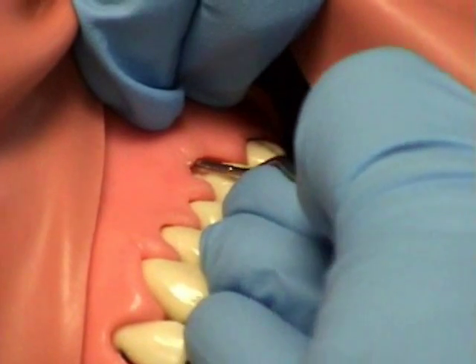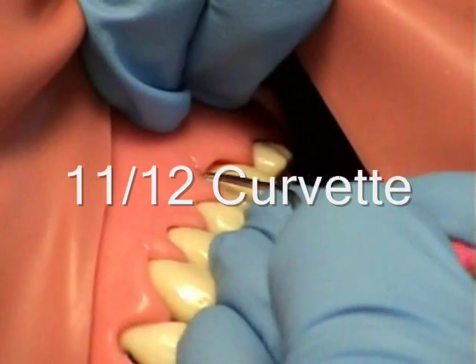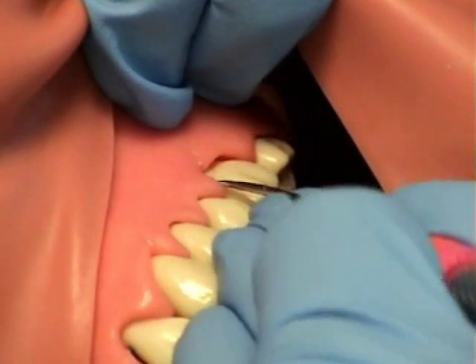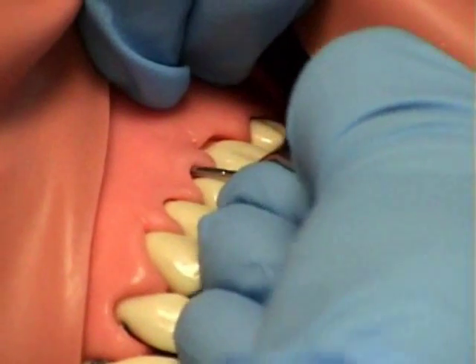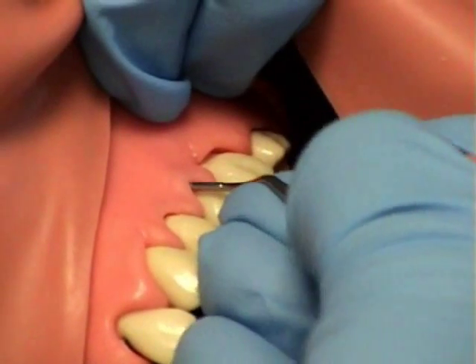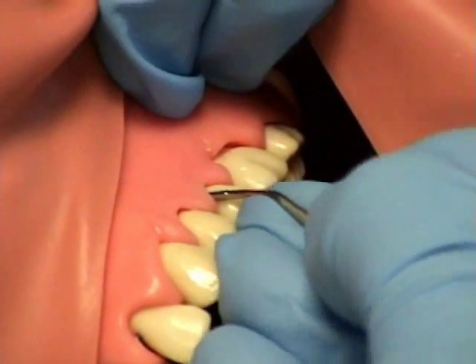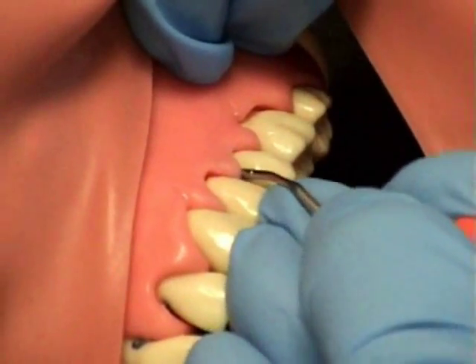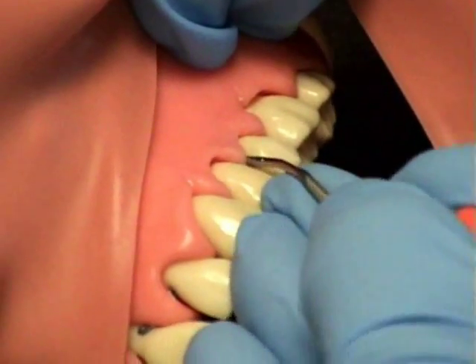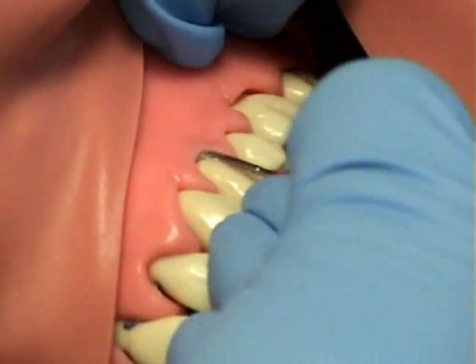Notice the 5mm line mark. Ms. Johnson is using the instrument to 5mm. She can visually see that line and then know how deep subgingivally she's going. Now she finds a pocket that is 10mm, or she knows that is 10mm from her periodontal probe readings, and therefore can use the instrument to remove the deposit all the way to 10mm by looking at the line on the curette.